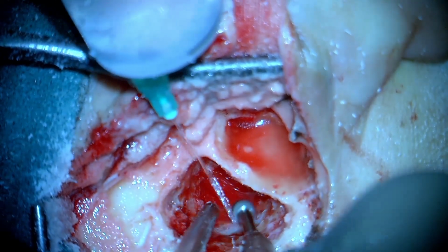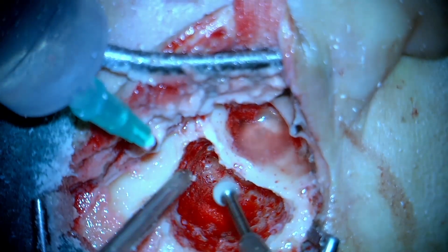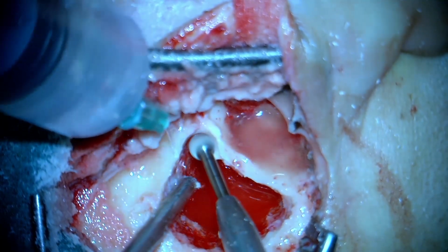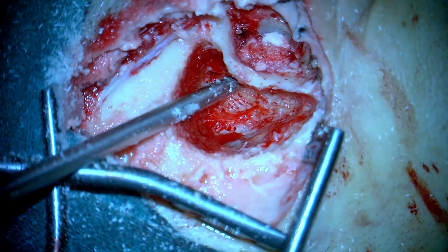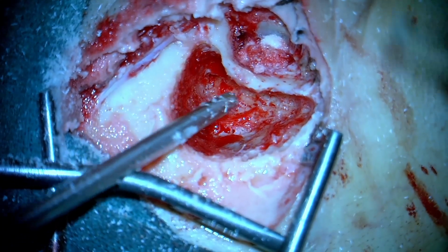You'll see we are just removing some mastoid air cells. We need not chase each and every cell here. That's not the point. The point is just to open the antrum and the mastoid air cell system, completely clear it, irrigate it using an ample amount of irrigation, and make this patient discharge free. As you see now, the antrum is open.